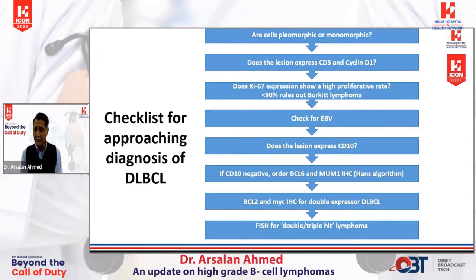Once I've got the GC, non-GC done, then the next would be BCL2 and MYC by IHC. And this is to determine whether it's double expressor and/or triple expressor DLBCL. And finally, if MYC comes out positive, the next thing I have to order will be FISH. So this is the basic algorithm I follow. And now I'll show you how I do it when I have a case in front of me.